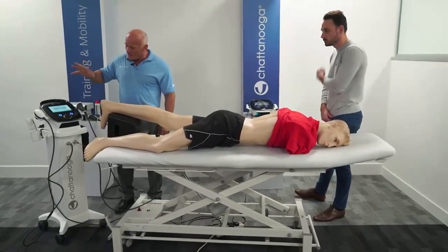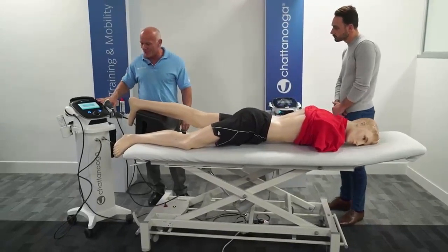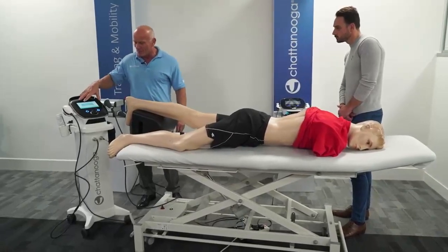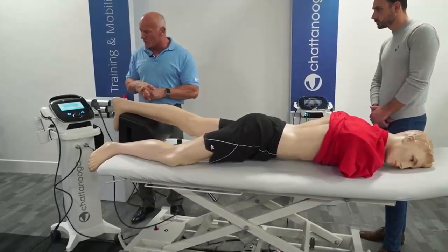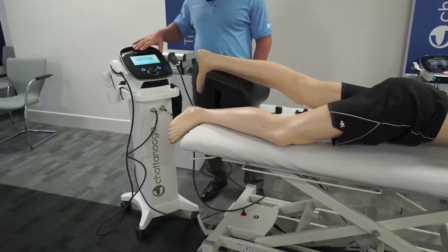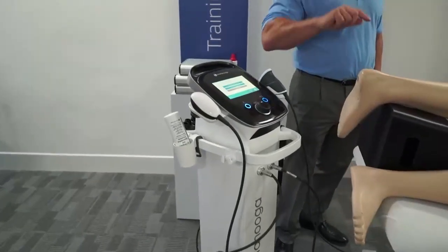I've been a Chattanooga user for years, so I've always had the branded colours. But moving to this new black and white really brings it into a modern era. I love the new screen. The screen is a true touch screen, where the last one was more of a press screen.